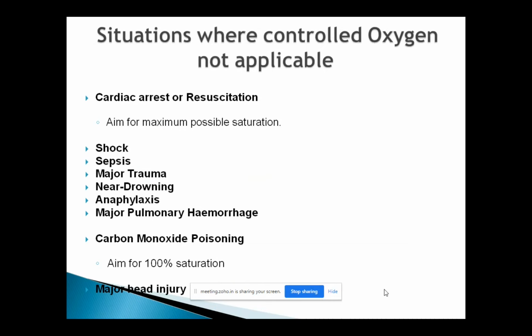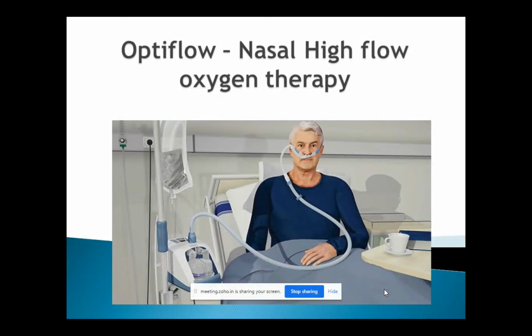Most of the time, we give cold water humidification to patients if they are on oxygen therapy. And obviously, we know that is not the right way of giving humidification. The actual humidification is that the water has to be at 37 degrees, body temperature, and that is the only way you can achieve an optimum humidity of 44 milligrams per liter. So using cold water humidification, even if they call it humidification, is not really the right way of humidifying the oxygen. So what is the current practice?